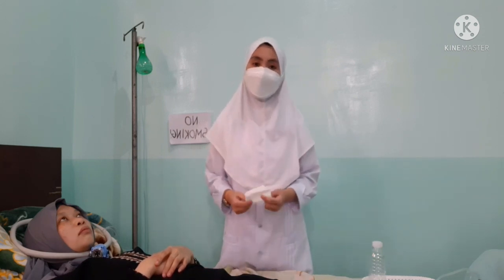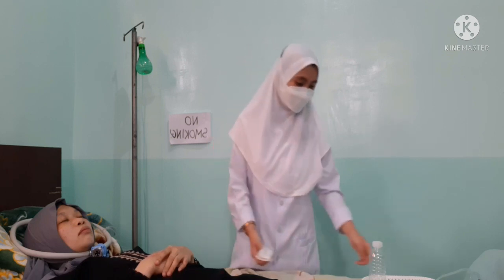The patient or caregiver can use the teach back method to demonstrate understanding of instructions. It's supposed to be that we already have instructed the caregiver. Now, we can provide the patient comfort measures to ensure safety.